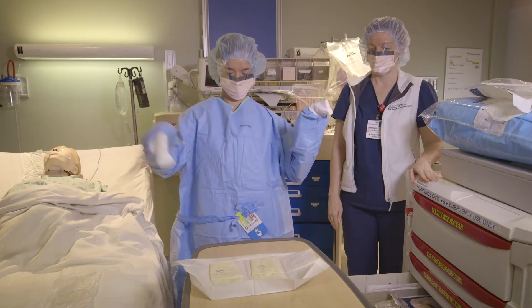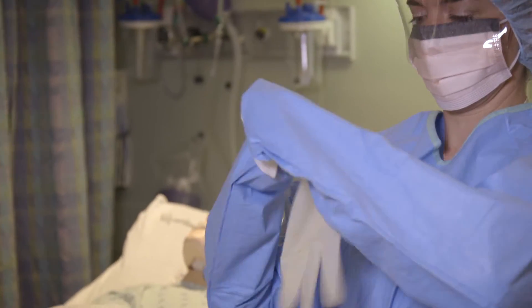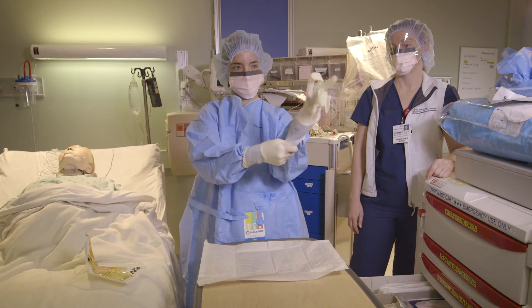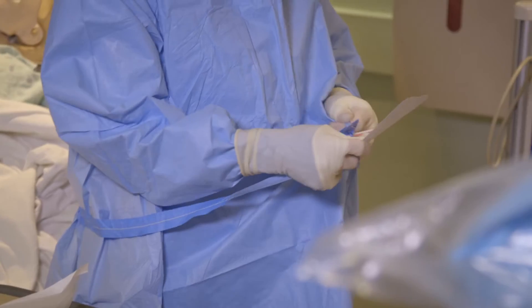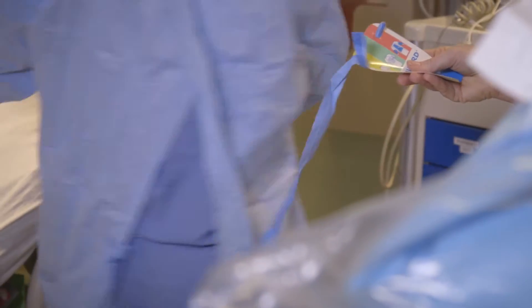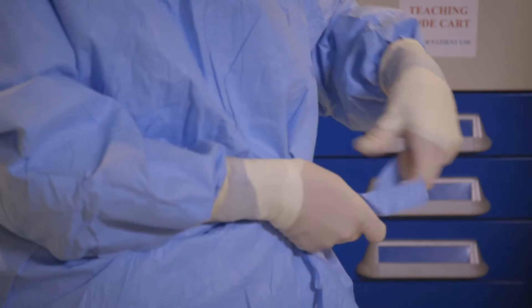Once your fingers reach the cuff of the wrist, you now put on your sterile gloves. Once gloved, you will grab the tag on the front of your gown and hand it to a co-worker. You will spin around while they hold the tag, and then you will tie yourself in the front.